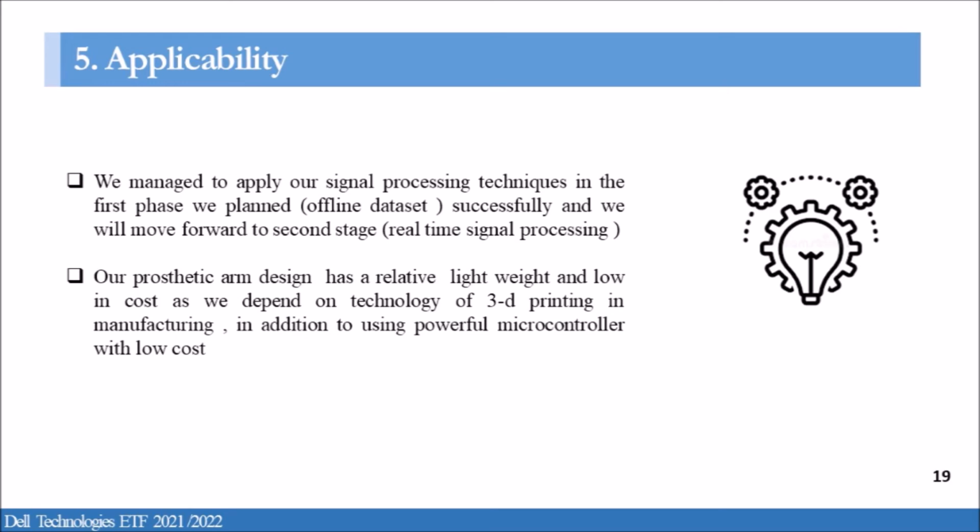For applicability, we managed to apply our signal processing technique in the first phase successfully, and we will move forward to the second stage, which is real-time signal processing. On the other hand, our prosthetic arm design is relatively lightweight and low in cost due to the technology of 3D printing and manufacturing. Also, we use a powerful microcontroller with low cost. So, as a conclusion, we can say our proposed method can be implemented on real ground.